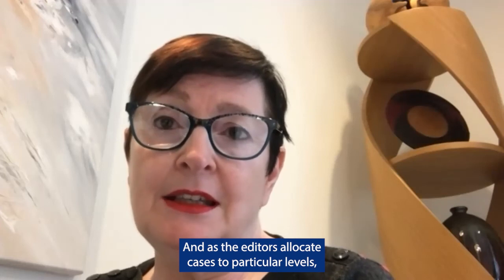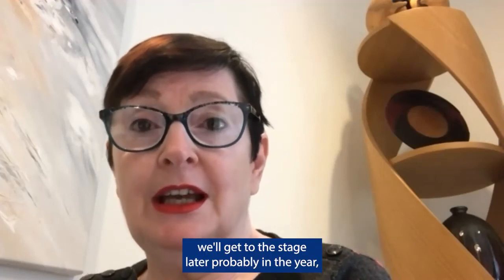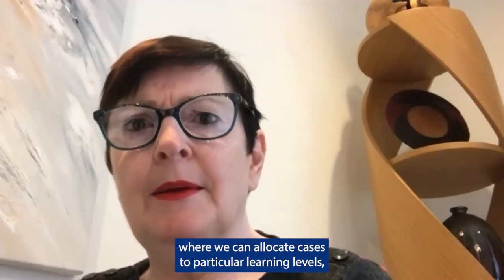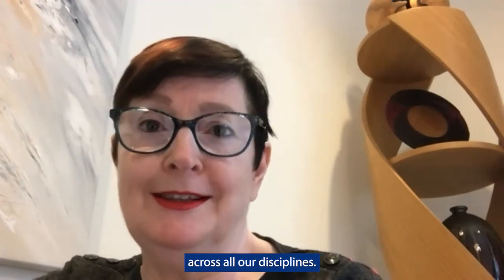And as the editors allocate cases to particular levels, we'll get to the stage later, probably in the year or early next year, where we can allocate cases to particular learning levels, particular curriculums, and we'll be growing the curriculum across all our disciplines.